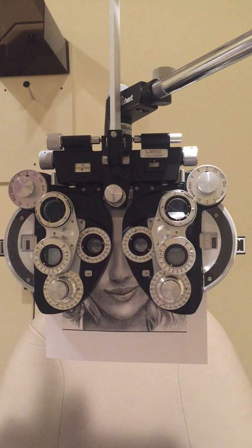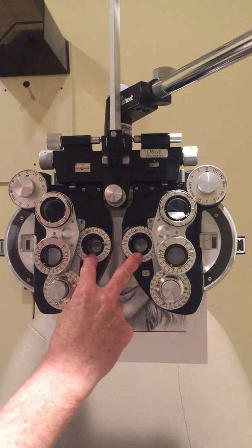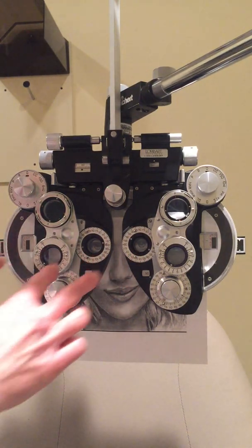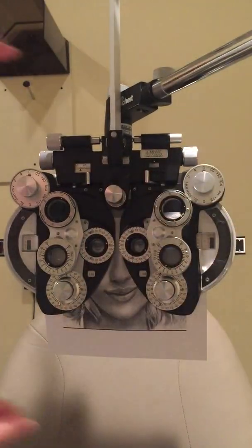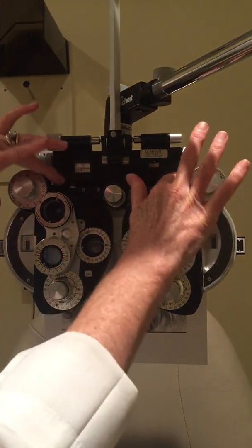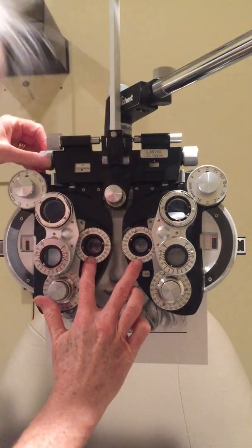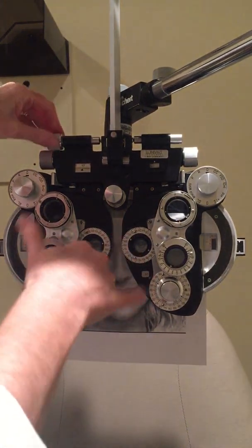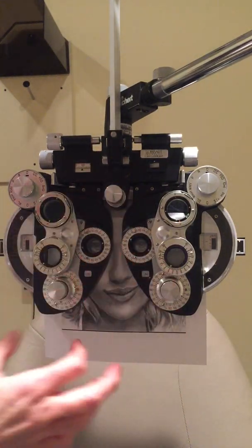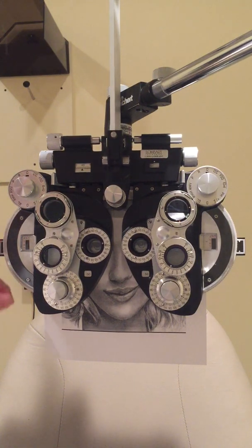This is a video on how to refract using a plus-cylinder phoropter. I want to make sure my patient's pupils are behind the lens wells, so I line them up. The near testing and distance PD settings are adjusted using this knob. If she has a bit of a head tilt, I can orient the phoropter properly so the lens wells are in front of her eyes.